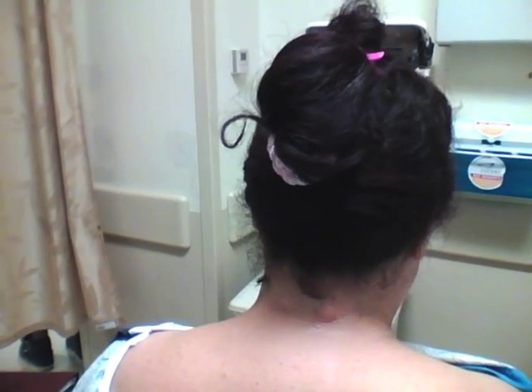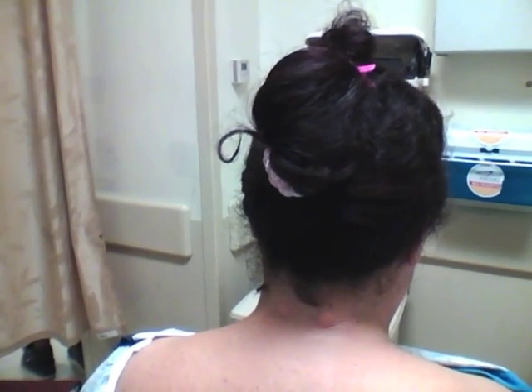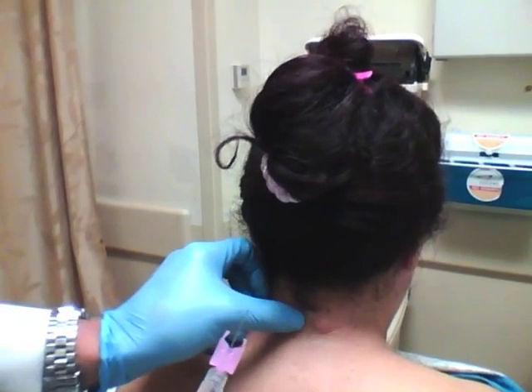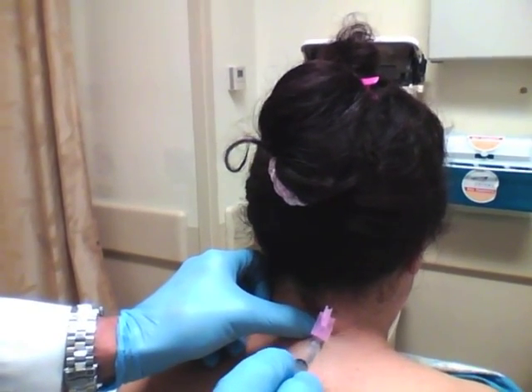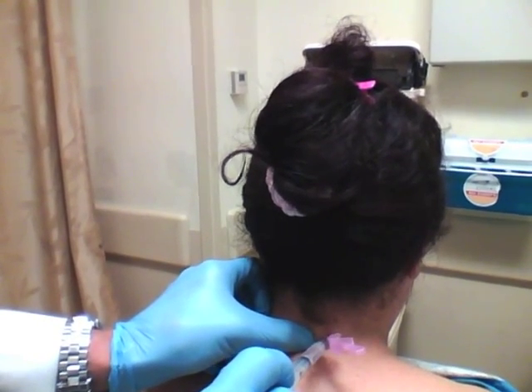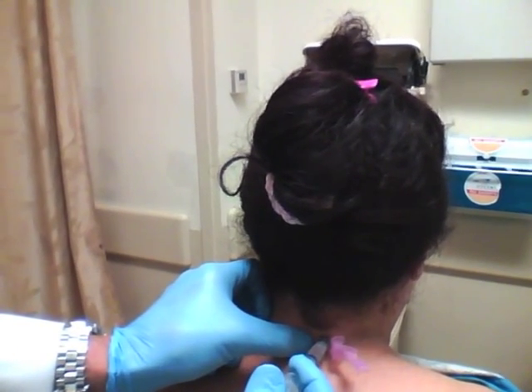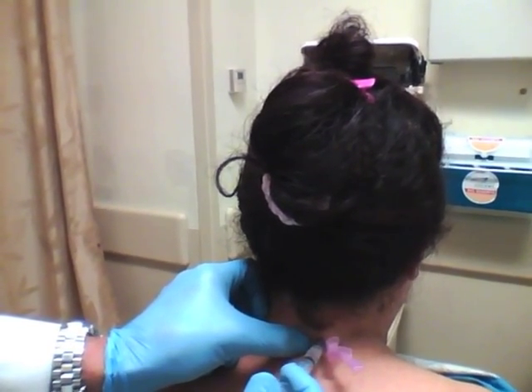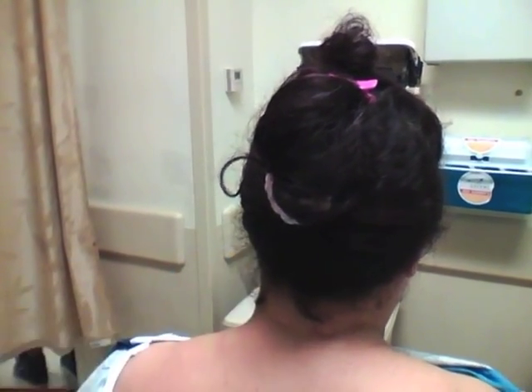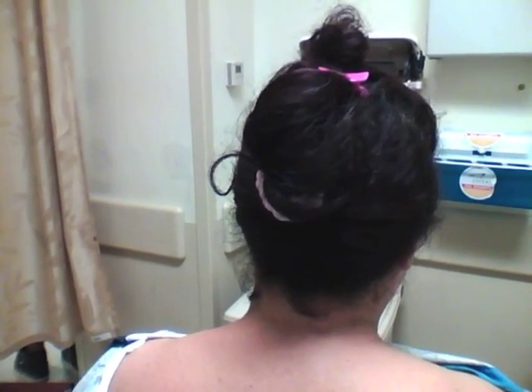I've got two syringes filled with bupivacaine — they each have about an inch and a half needle and one and a half cc's of bupivacaine. We're going to go straight in, parallel to the ground, aspirating as we go in. I slowly put in the bupivacaine and pull out just a little bit as I put the last bit in. One side done, and we're going to do the other side now.